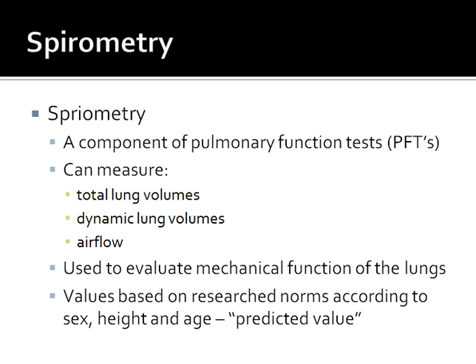So it gives us a better picture of not only the amount of air entering or leaving the lungs, but how the lungs and the airways are influencing that airflow and the volumes that we're achieving. And so it's a way of evaluating the mechanical function of the lungs. What we do is we measure individuals' lung functions, and I'll go on to that in a moment.